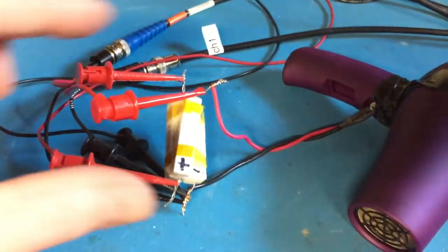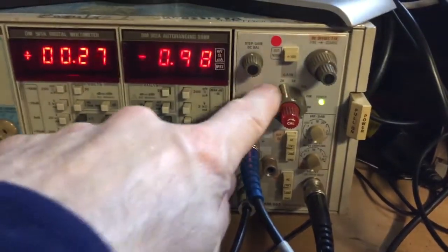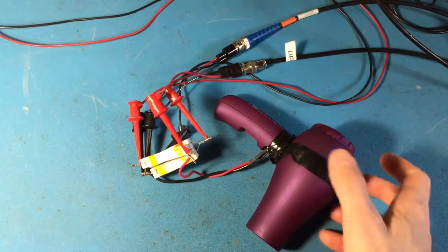The Wheatstone bridge is measured using a differential amplifier. Right now we're using a commercially available differential amplifier, so it has a gain of 2000. These are two inputs. Output goes to the oscilloscope.